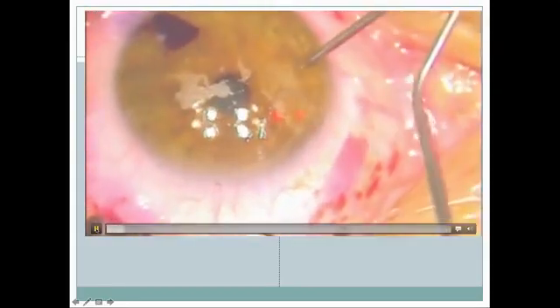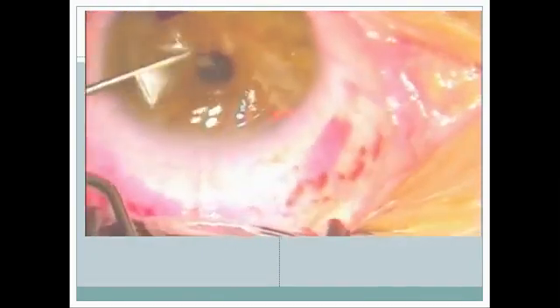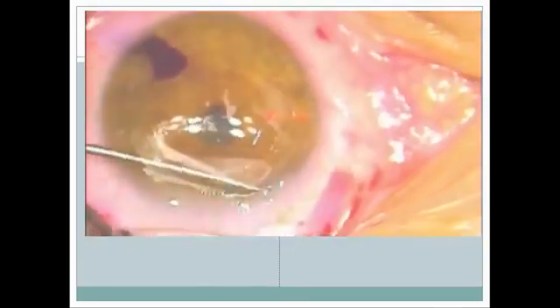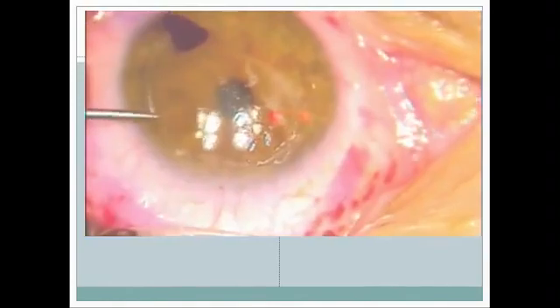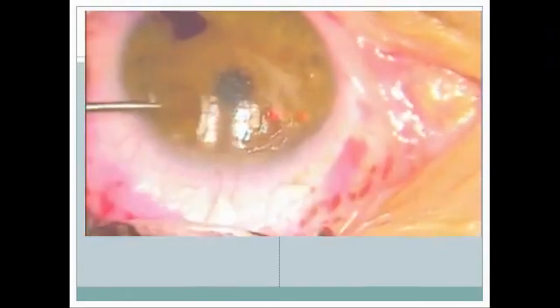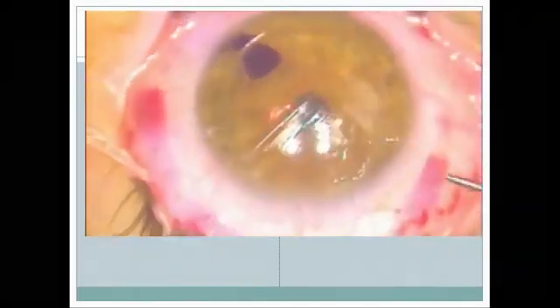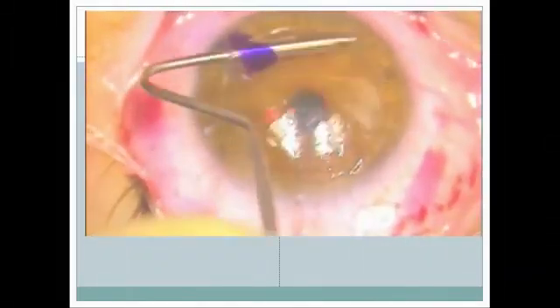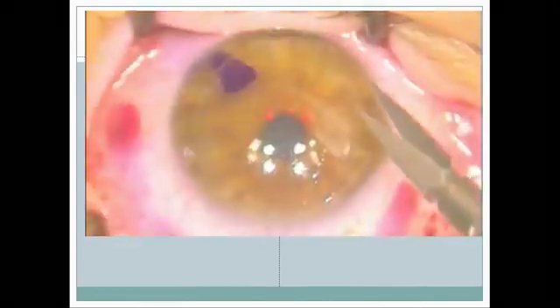I go to lift my flap. By habit, I go to the area where I normally start it, and then I say to myself, no, I'm going to start on the other side where I know my raster pattern and my side cut were great. I slowly, deliberately try to open this up. I'm running into some areas where it's not opening as quickly, but I'm going to continue. If I were unable to open this up, what I probably would have done is just lay it back down, wait 2 weeks, and come back and do an advanced surface ablation if the refraction and the topo were complete. But here I'm getting most of it, except for this one small area.